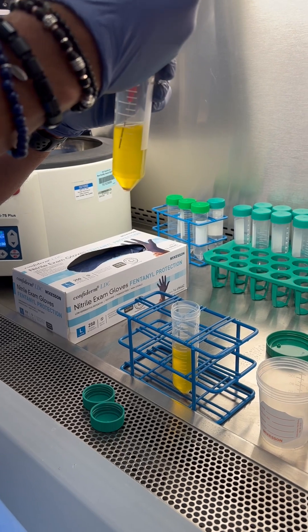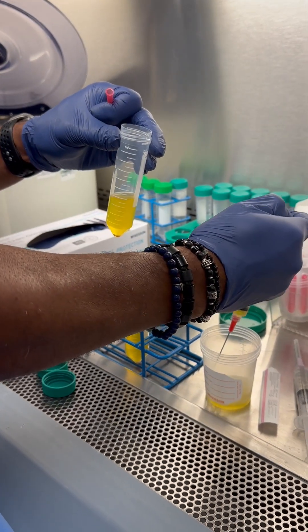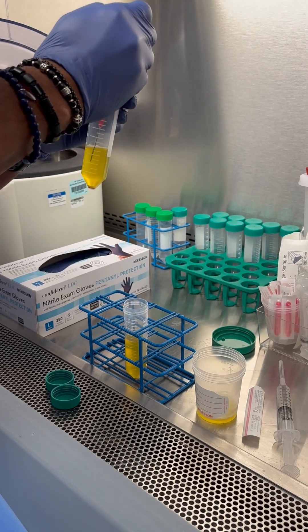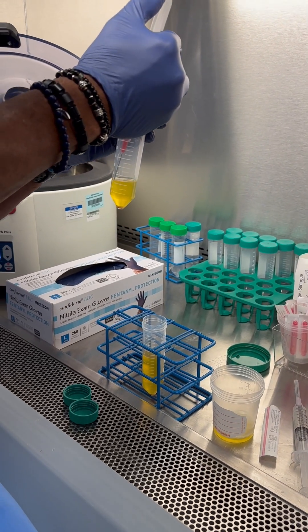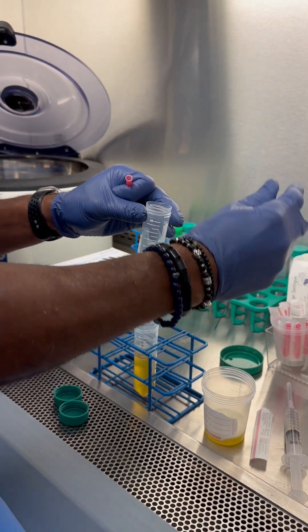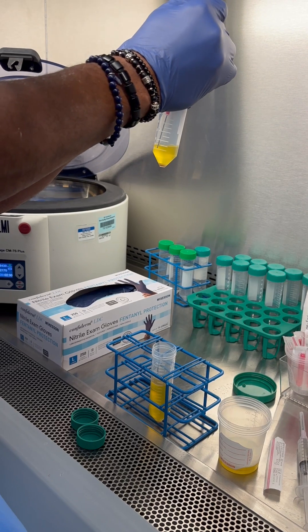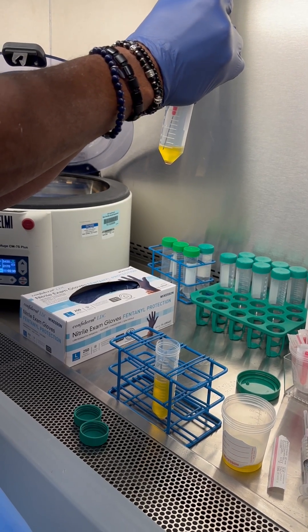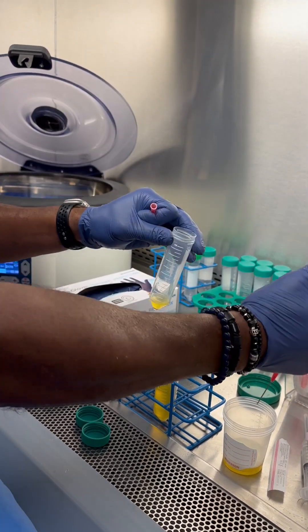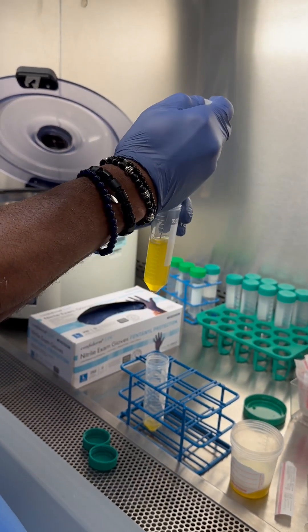We're not filtering today because I don't have a filter. Everything here is clean — I just opened a new syringe and a new blunt-tip needle. We go through needles frequently; I open a new needle often. That's five — that's about four cc's there. We'll go to about three on this one.